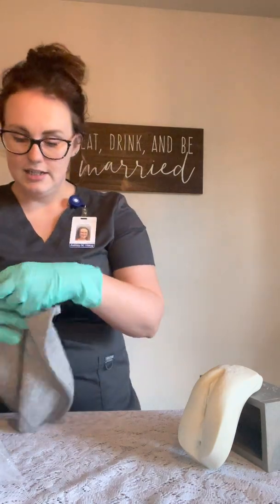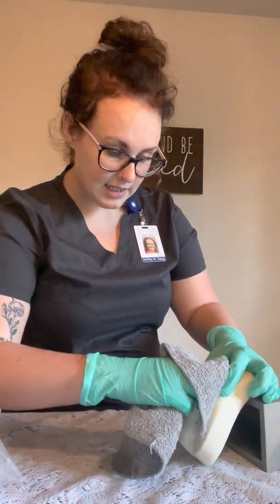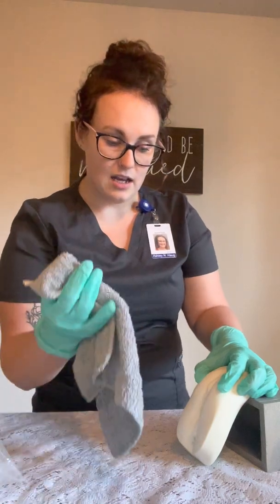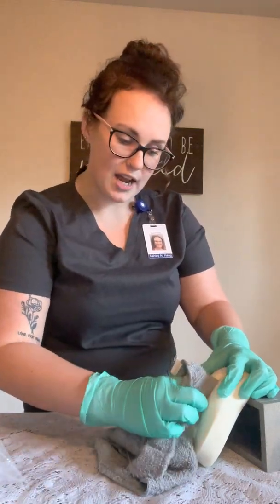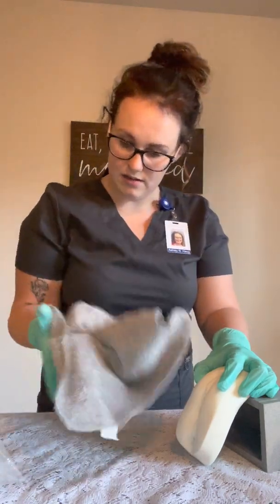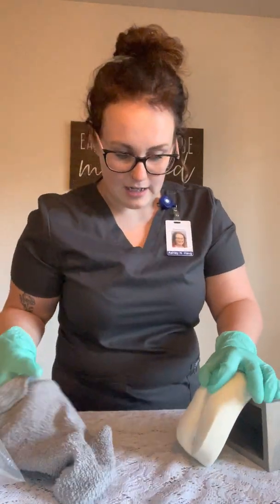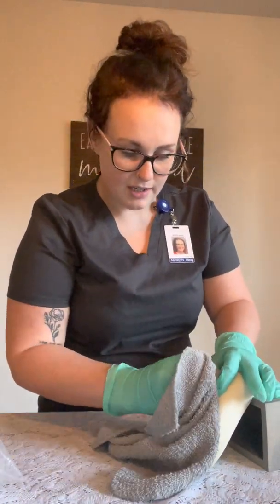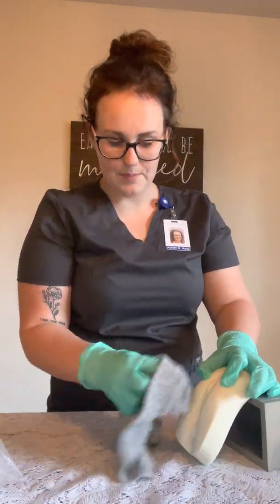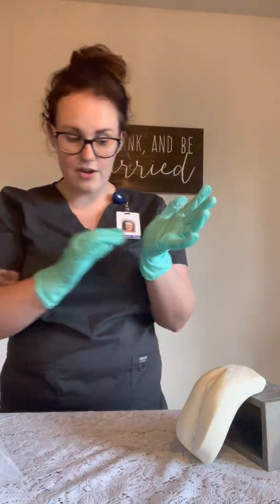All right. So now that we've got you in that position, I'm going to go ahead and clean this area. I'm going to use a new side of the wash rag every time that I wipe so that I'm not contaminating. Okay, and I'm also opening up the labia here so I can make sure this whole area is cleansed. Okay, so now I'm going to place this out of our way.